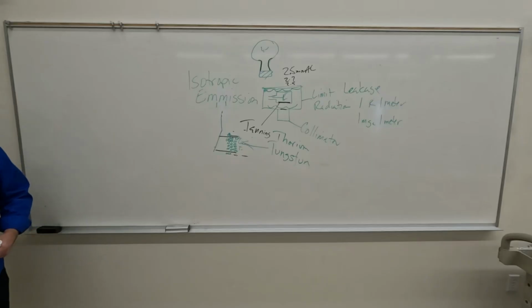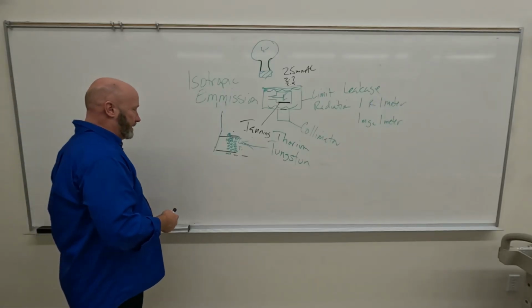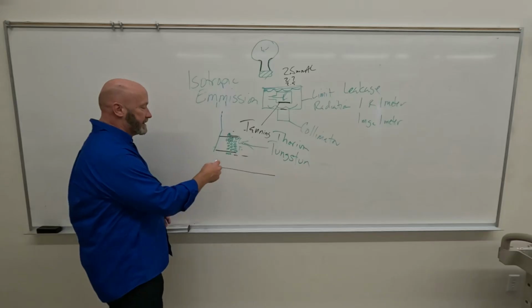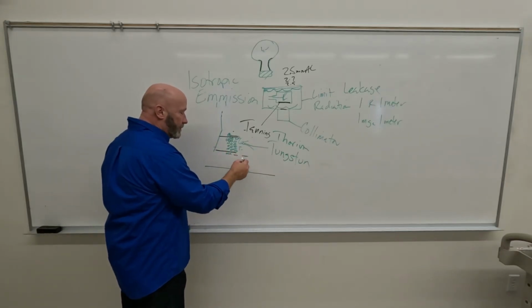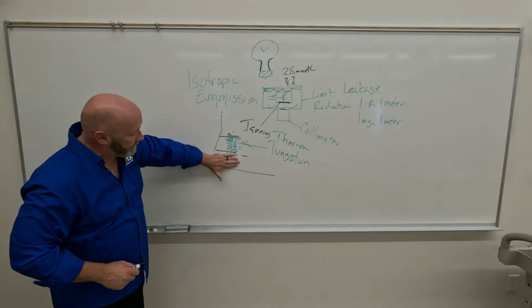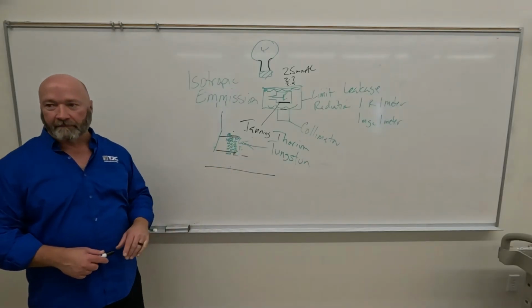If you could engineer a component that is made of a conductor, but you engineer it in such a way that these electrons going from cathode to anode are not attracted to that metal envelope, they ignore the metal envelope and go from cathode to anode, even in the presence of the metal envelope.